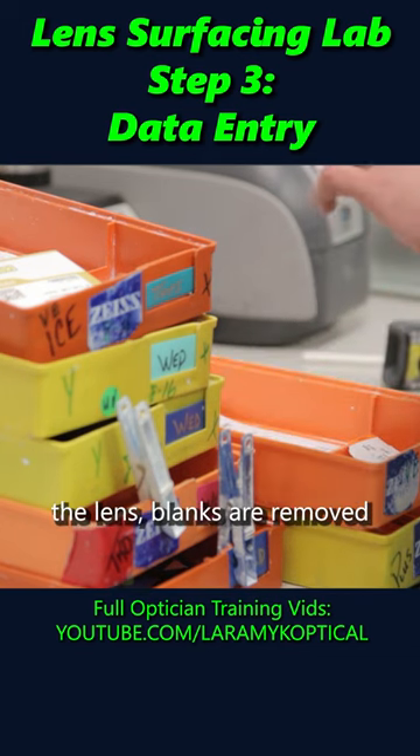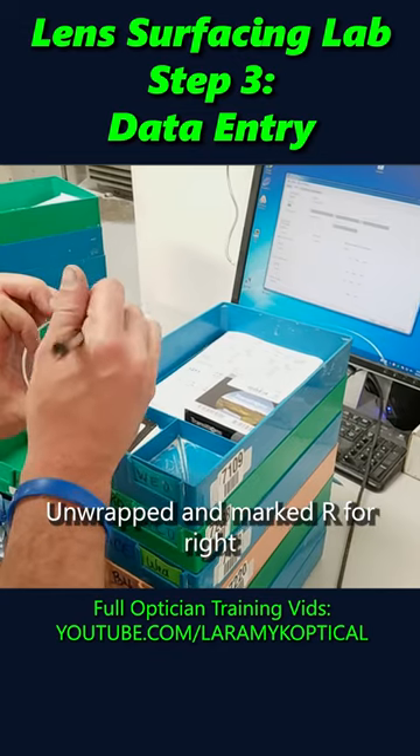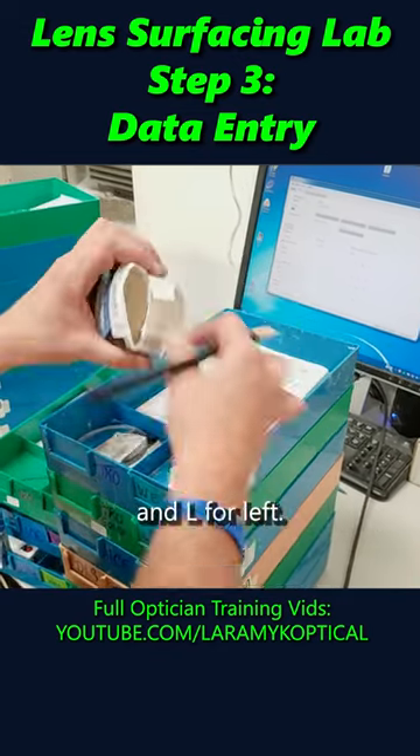Once verified, the lens blanks are removed from their box, unwrapped, and marked R for right and L for left.